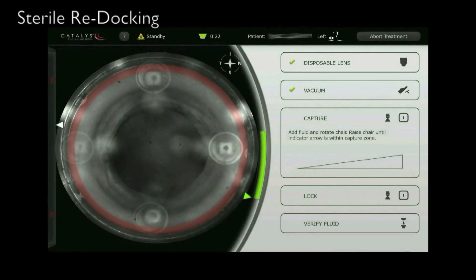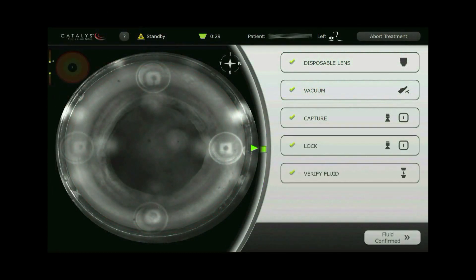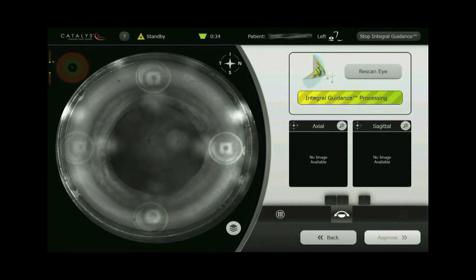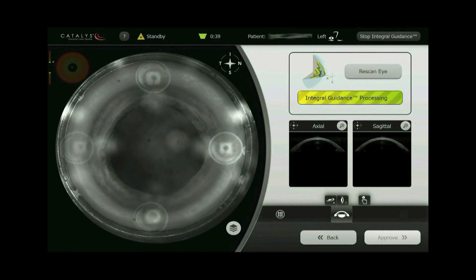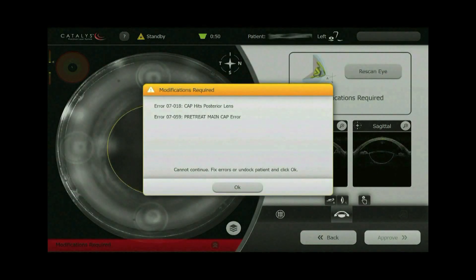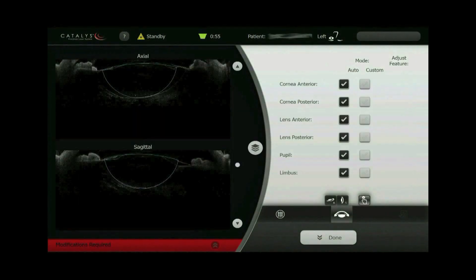With only 10 millimeters of mercury rise in intraocular pressure, the same eye is redocked and the patient is rotated under the laser to begin another treatment with the Catalyst — this time a 4.8 millimeter posterior capsulotomy. Integral guidance rescans the eye and suggests that modifications are required due to the detection of abnormal ocular surfaces.